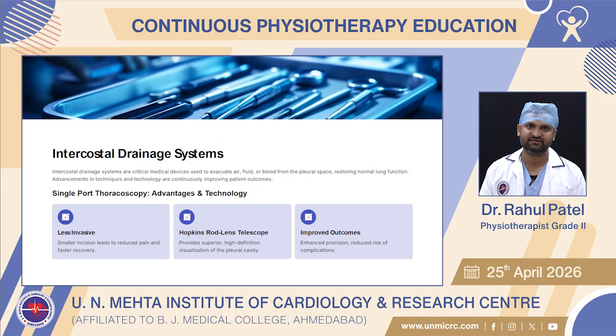Intercostal drainage systems are critical medical devices used to evacuate air or fluid or blood from the pleural space, restoring normal lung function. Advancements in technique and technology are continuously improving patient outcomes. Single port thoracoscopy, advantages and technology.